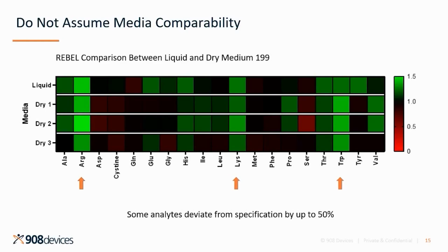Researchers need to work with established cell media providers to ensure that their cell media choice is appropriate for their application and that the handling of the media once it's received is correct. Researchers should consider a frequent analysis of their cell media whenever new batches and lots are received, periodically during storage, and during experiments.